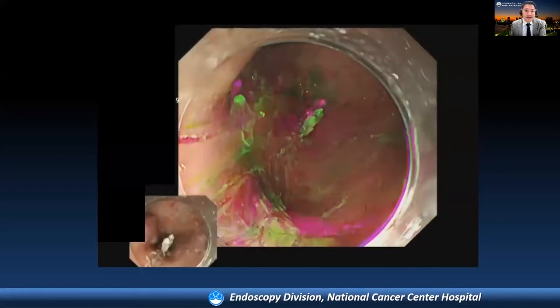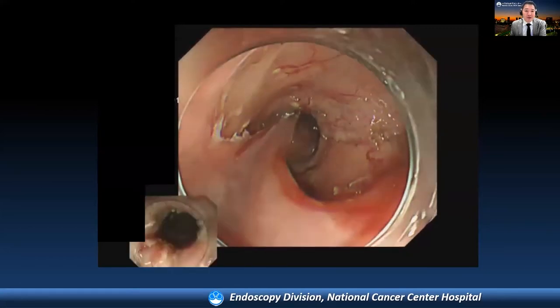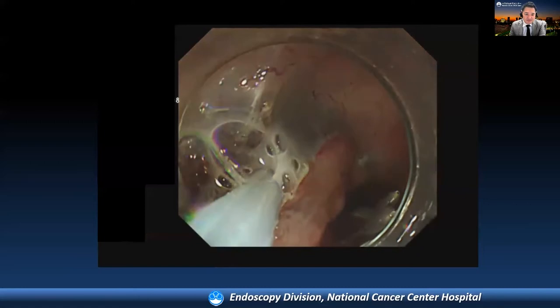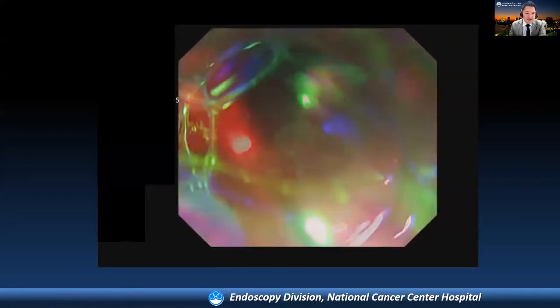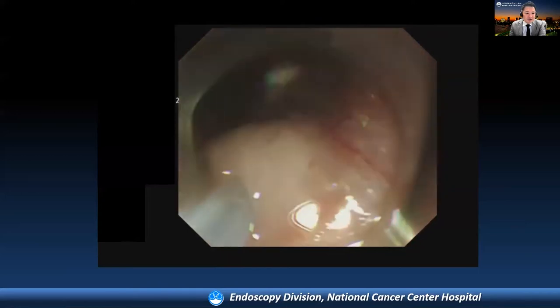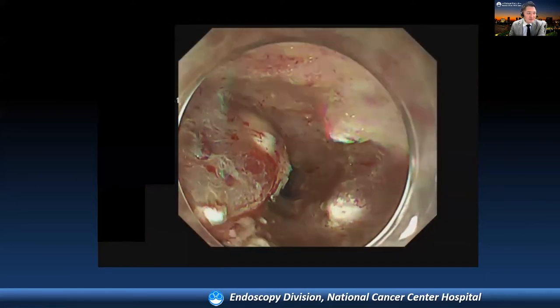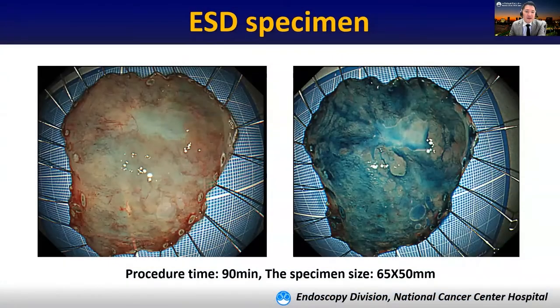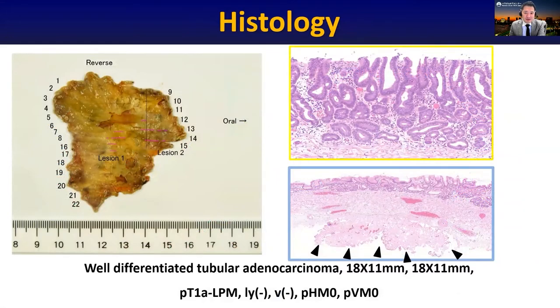As you can see, at the semi-circumferential mucosal defect, the extensive mucosal defect involved more than 90% of the luminal circumference. After that, for the prevention of post-ESD stricture, we performed local triamcinolone injection. Triamcinolone acetonide was injected on the mucosal defect and multiple blebs were created after the injection. Here you can see the local recurrence was successfully removed endoscopically. The lower right image shows severe fibrosis due to the prior EMR attempt, where I dissected with the IT knife nano device.